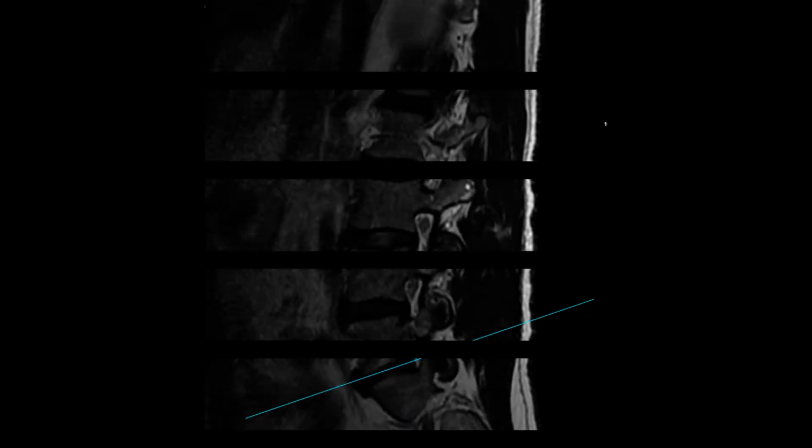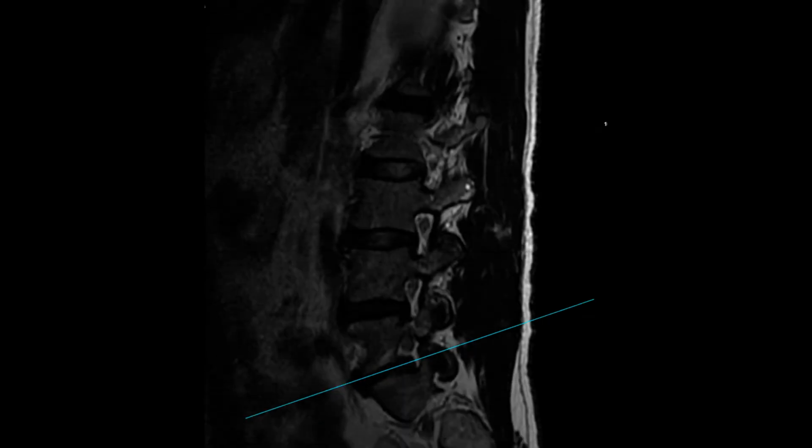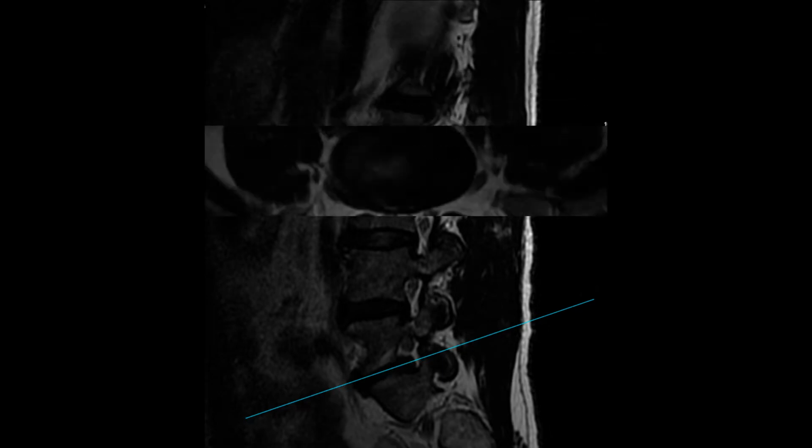If we look here at the T2 sagittal MRI, you notice a little bit of disc bulge into the foramen of the L5S1 disc space. You can notice some ligamentum flavum coming off the SAP as well, so somewhat stenotic foramen. The T2 axial is typically where the money is at. The L5S1 foramen on the right side here, a little bit of a hypertrophic facet.